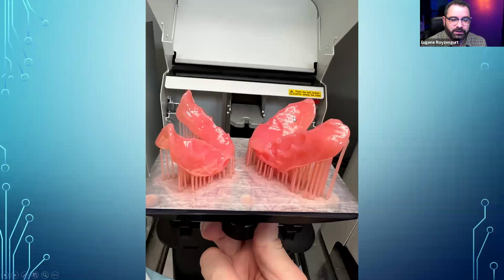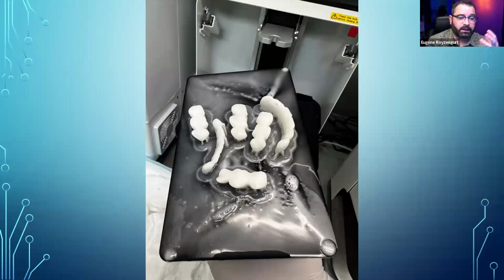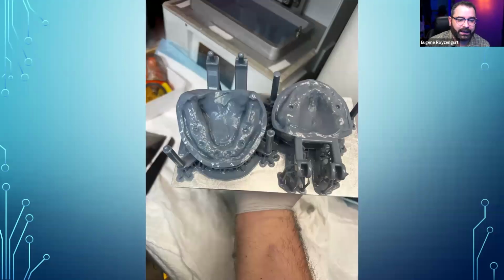So what I try to do is place my posterior palatal seal on my upper maxillary base plate away from the build platform, okay? Then you print your teeth, obviously separately as well, okay? And I also wanted to print some models just to check and verify, make sure my vertical is okay and everything else.